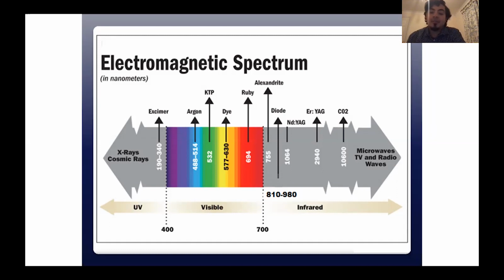So it goes without saying that when you're using soft tissue lasers, we do need to consider eye protection, and we do need to consider trying to protect the eyes of everyone that's around us, simply because the laser could be working and could be on. We just can't see it because it's not actually in the visible spectrum. So that's something always worth mentioning. More specifically, the area that we're going to be looking into is the 810 to 980 nanometers region.